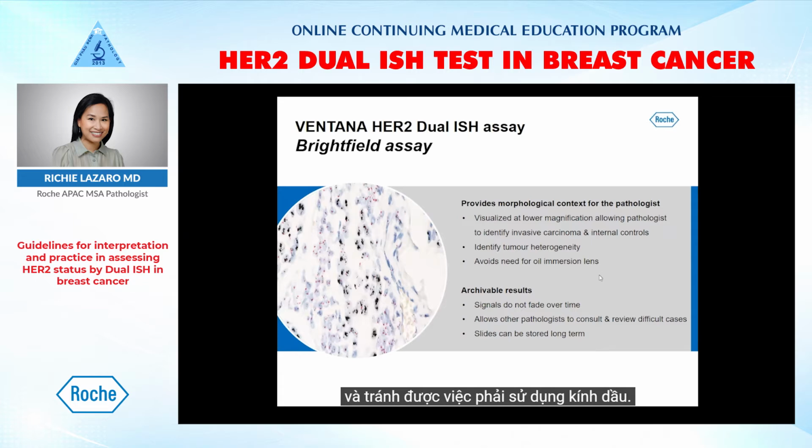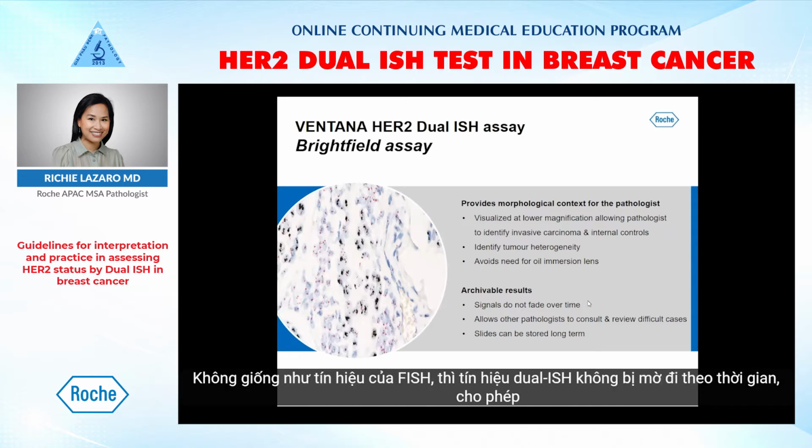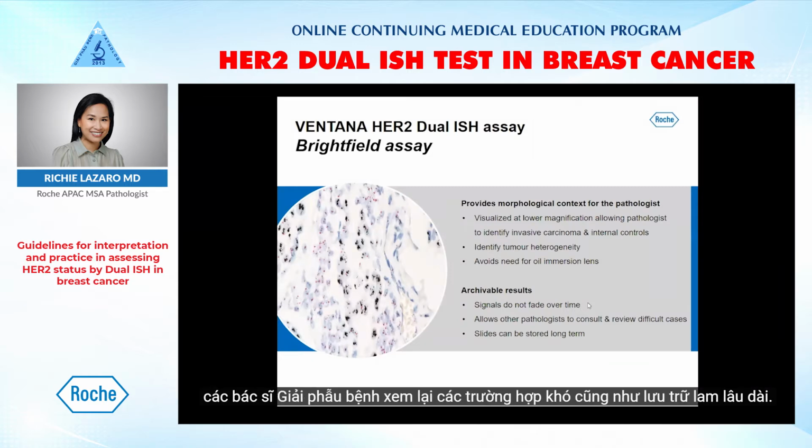immersion lens. Unlike FISH signals, dual ISH signals do not fade over time, allowing other pathologists to review difficult cases, and the slides can be stored long-term.